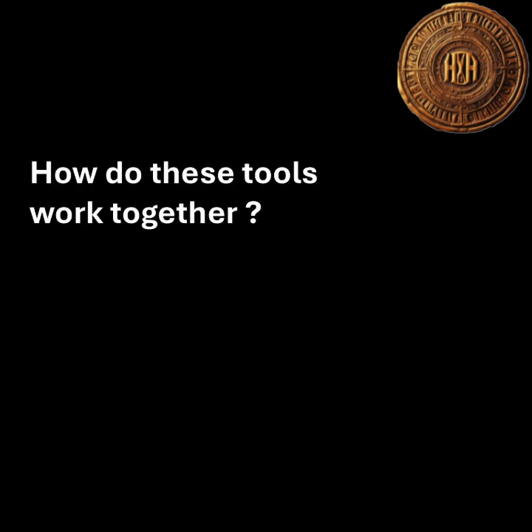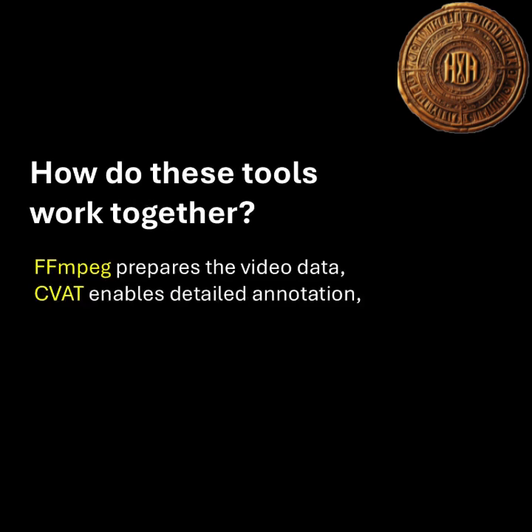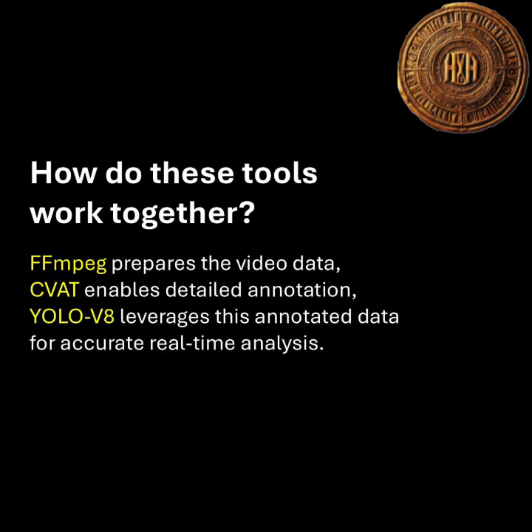How do these tools work together? The synergy is clear. FFmpeg prepares the video data, CVAT enables detailed annotation, and YOLO V8 leverages this annotated data for accurate, real-time analysis. This combination empowers researchers and medical professionals to develop AI solutions that improve patient outcomes and revolutionize surgical practices. That's fascinating.